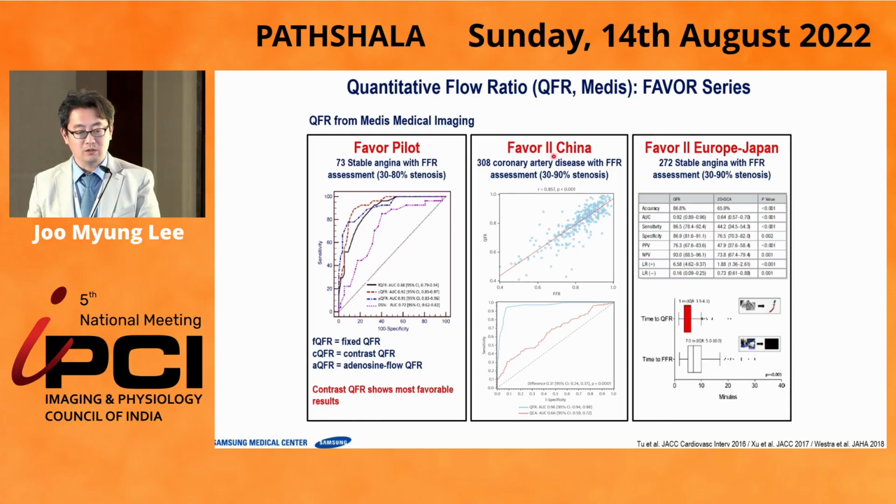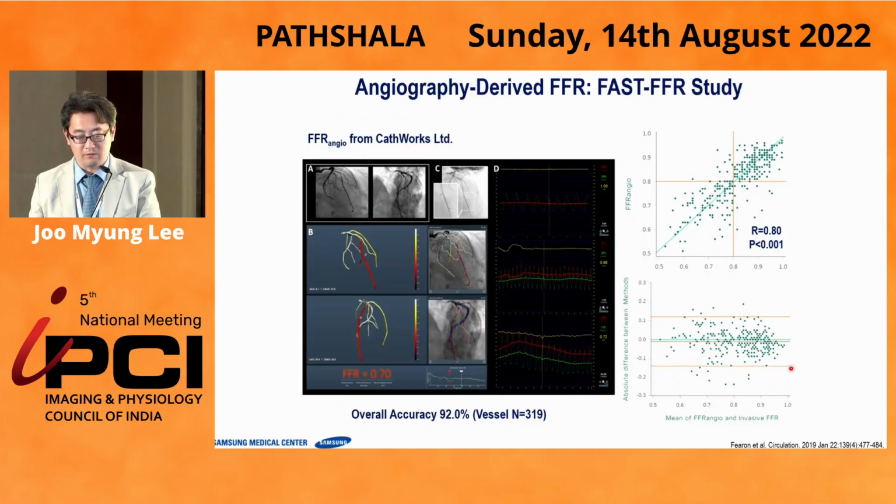And later studies, FAVOR II China, also showed excellent accuracy of QFR, and FAVOR II Europe-Japan showed also very good agreement between QFR and invasive FFR, and more importantly, time to QFR was much shorter than the invasive FFR.